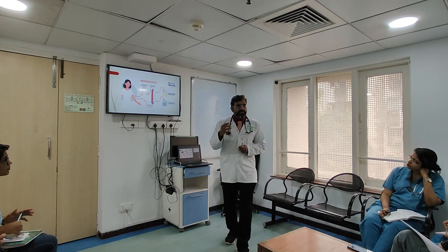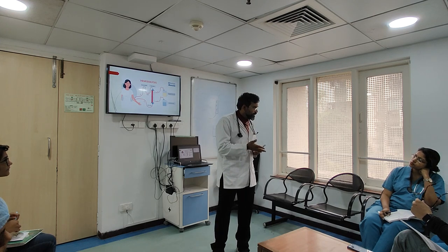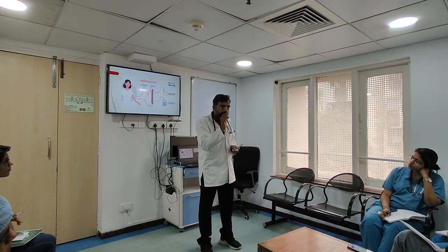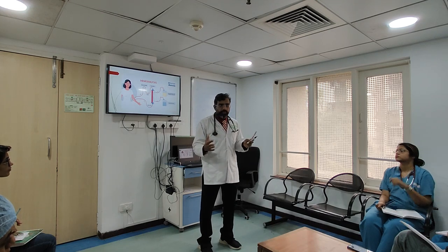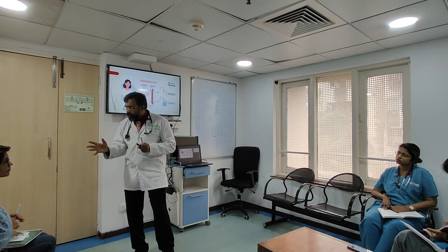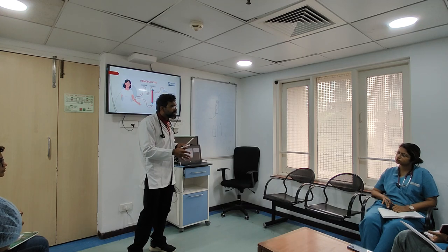Classically, 0K dialysis should not be done unless there is life-threatening hyperkalemia. Even there, you don't give 0K dialysis all the time because the body's potassium will become zero. Are you understanding? The more the difference between the solutes, the more the movement of the solutes. So dialysate can be modified. You can have 0K, 2K, 4K. 0K is extremely dangerous dialysis.